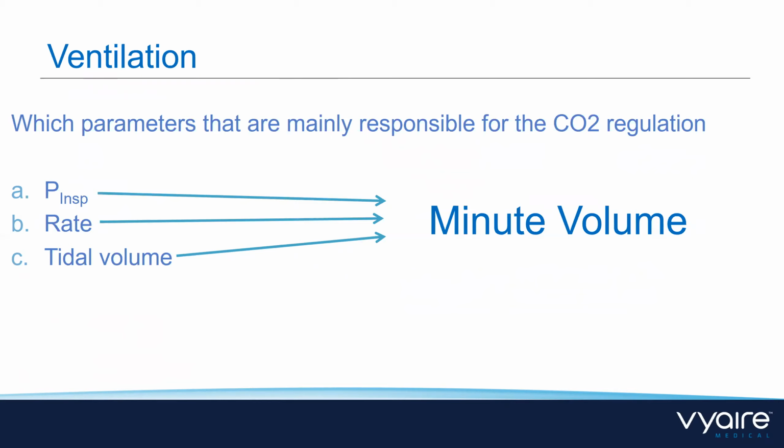So the oxygenation part has to be done in a way that you're used to. You set the FiO2, you set the PEEP, and so the oxygenation is managed in a very usual way. But now these three parameters are managed by AVM automatically. The only thing you have to take care of is the minute volume.